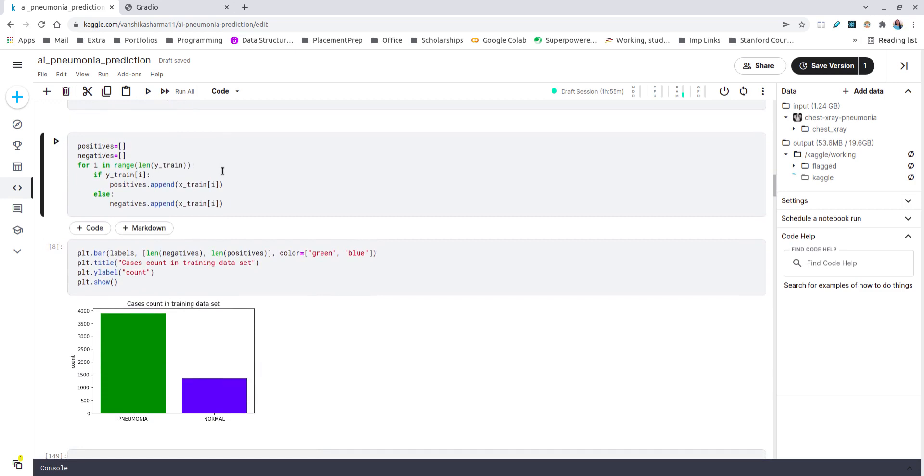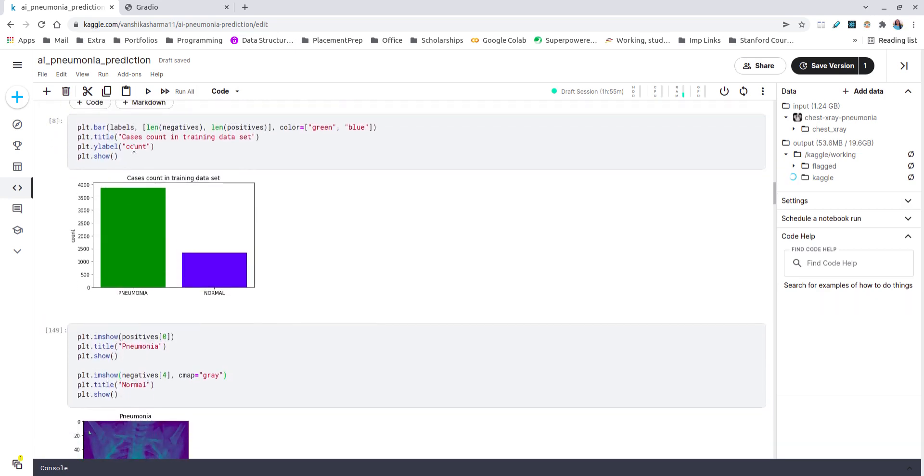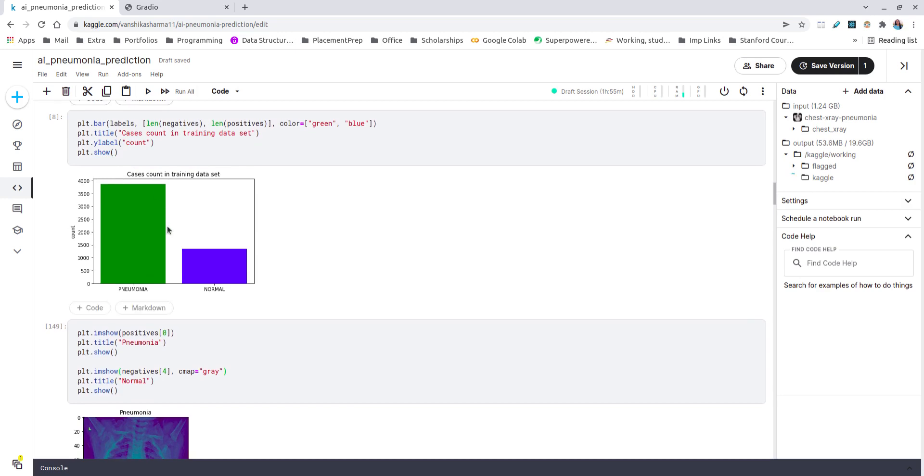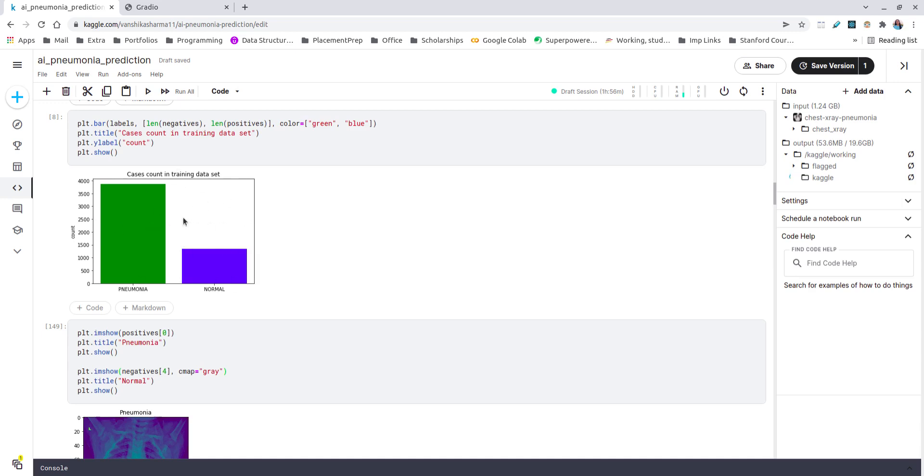In this cell I've tried to distinguish between the positives and negatives. I'm trying to count the number of pneumonic data and the normal data into lists. I did it for visualizing a very simple bar plot which gives me the count of pneumonic X-rays and normal images in my dataset, and it is very much clear that the pneumonic images are more than the normal images. We need to do something with our dataset which is a very simple step of normalizing our dataset to remove this bias which can be created by having a larger number of one class inputs.